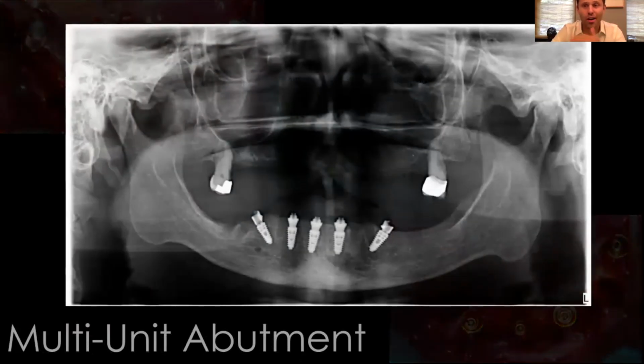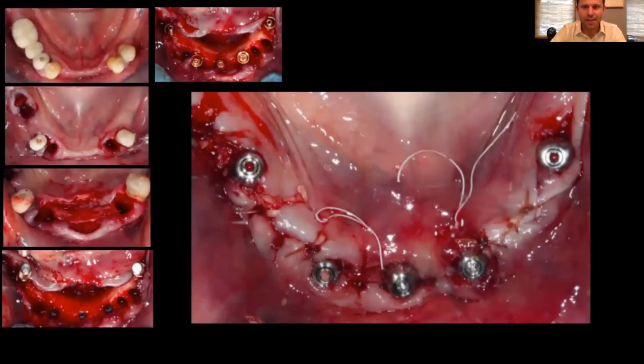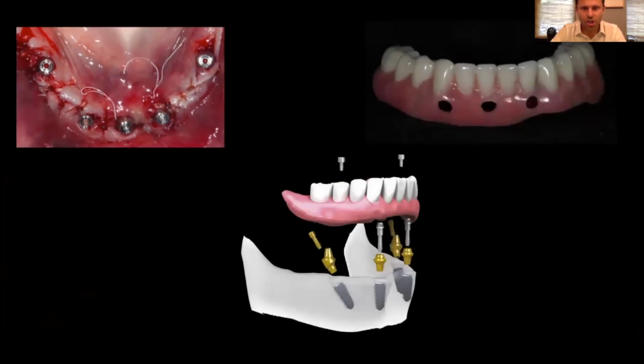And then we're working at abutment level from here on out. You are never going to the implant again. Day one, you are putting the abutments in, multi-unit abutments, and you are working off of them. You can see this is day of surgery, putting just some healing collars on. And then while I'm doing the conversion, you use temporary cylinders to go directly attaching to the abutments.